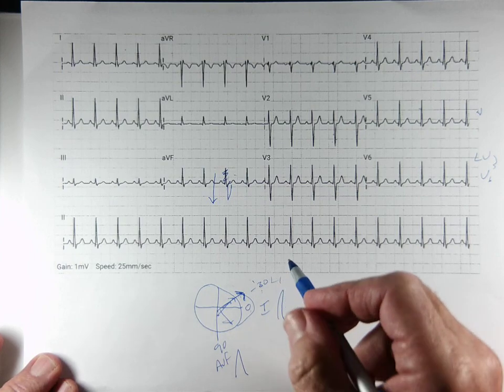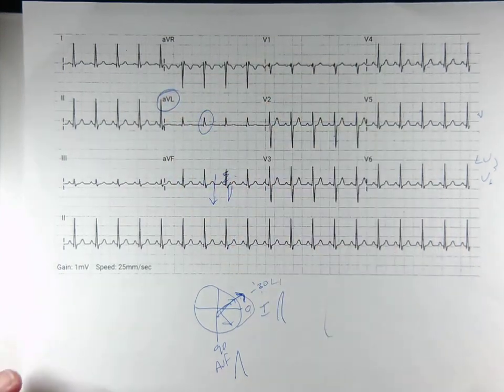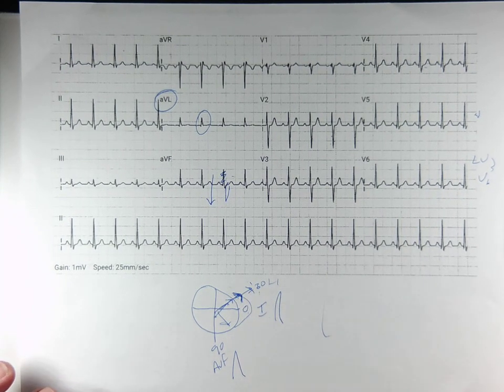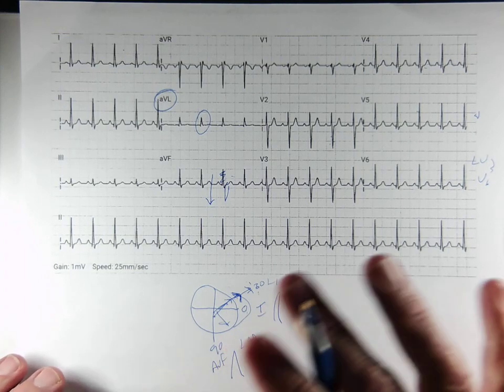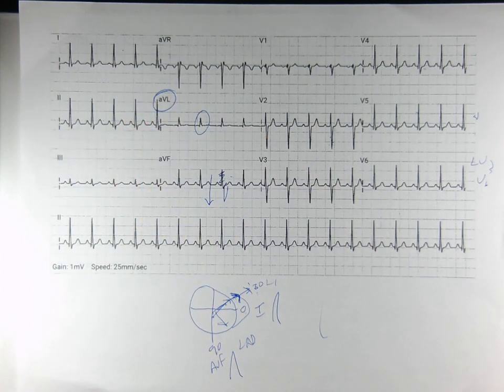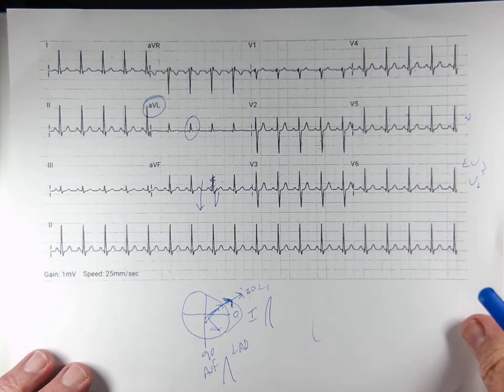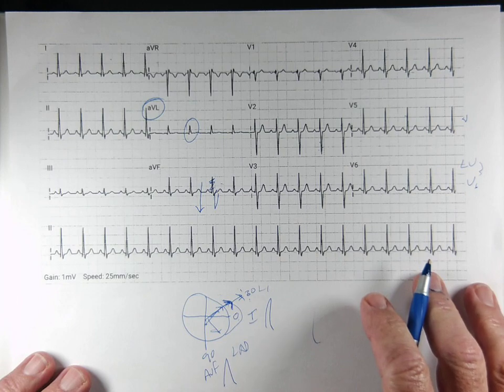The left shoulder. Which is the left shoulder lead? aVL. So you would definitely see a positive R wave, and it might be quite larger than normal in some cases if you have hypertrophy. So this would be what we call left axis deviation. And there's other right axis deviation and other things we'll talk about. So those are the only two leads you look at for axis. Okay. And that's kind of how all that comes together in terms of how we look at the leads. All right, thank you.